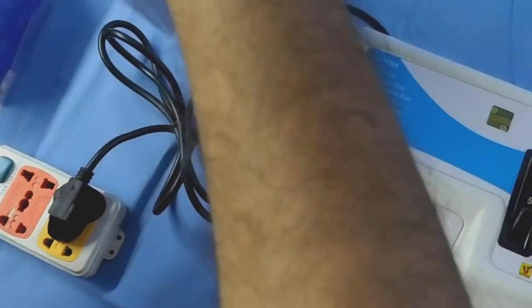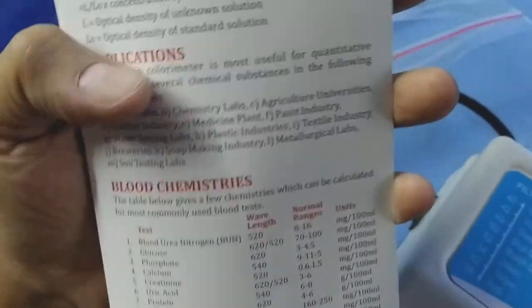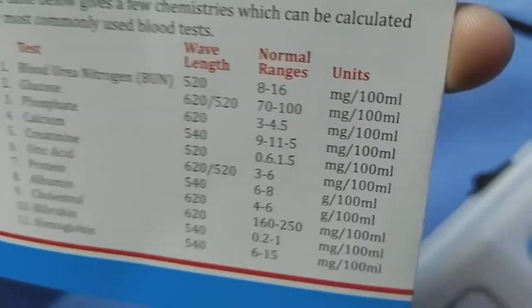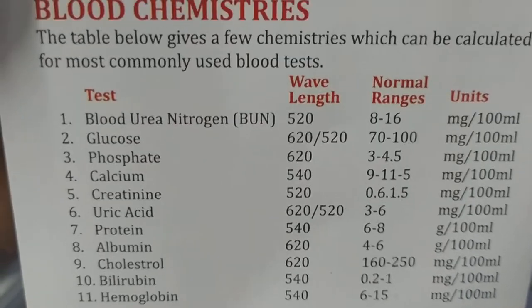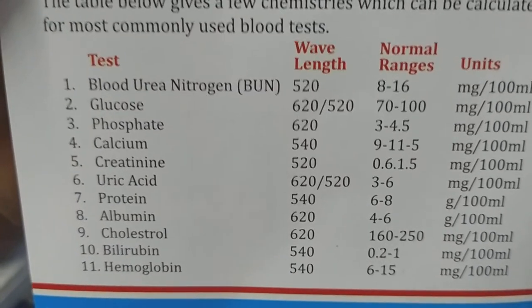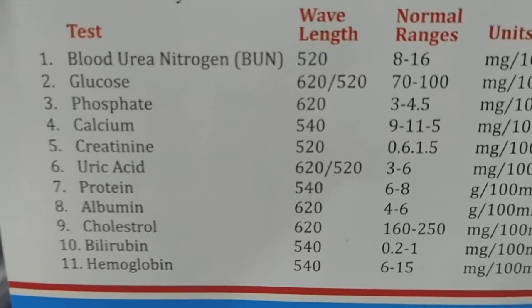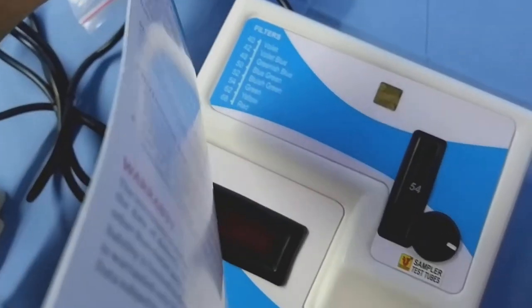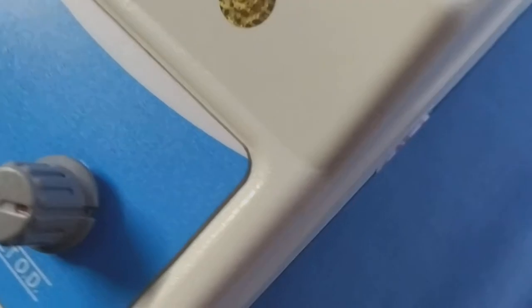With this colorimeter, 11 types of tests are possible of blood chemistries: blood urea nitrogen, glucose, phosphate, calcium, creatinine, uric acid, protein, albumin, cholesterol, bilirubin, haemoglobin. Now, how to use this colorimeter?